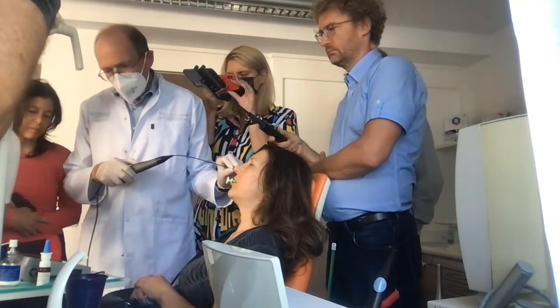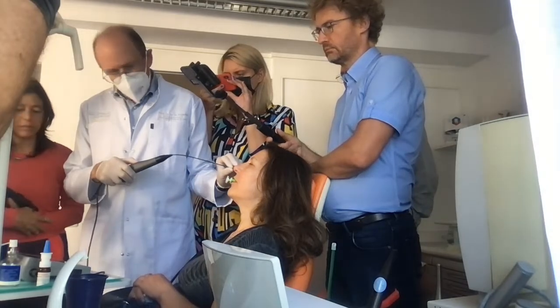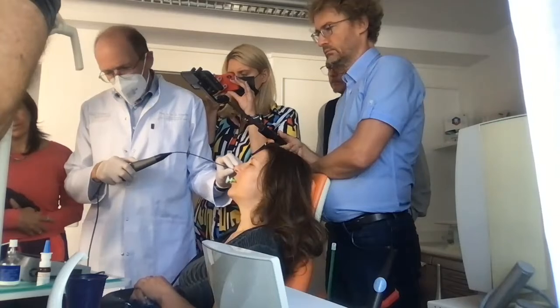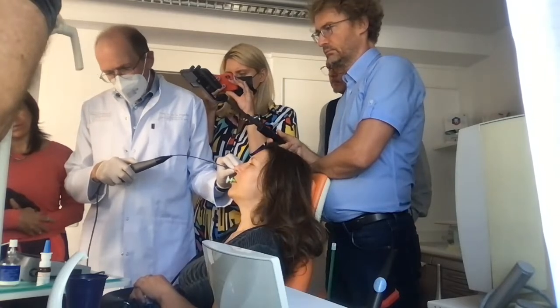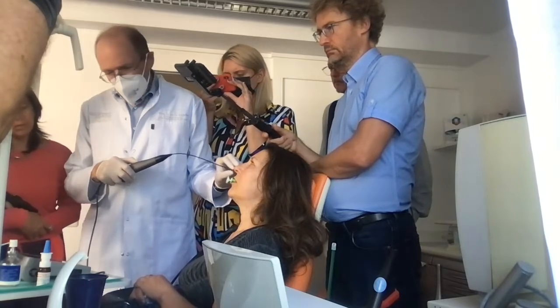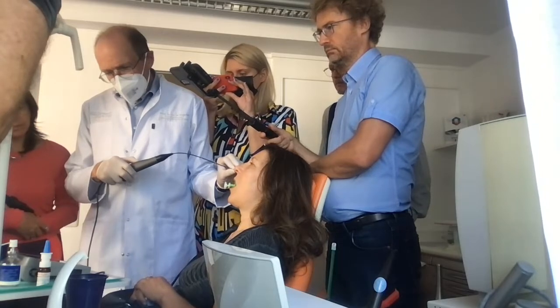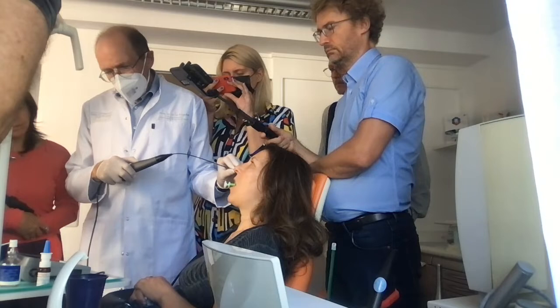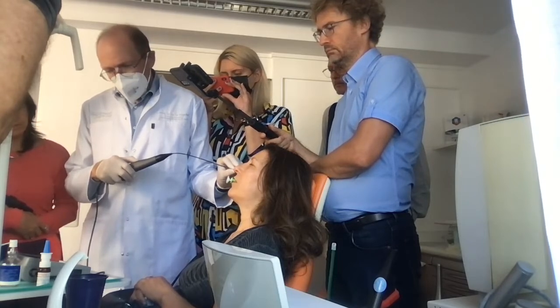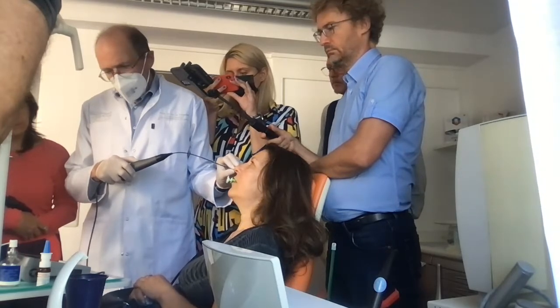Okay, please put negative pressure and breathe. And breathe. Nice, well working. So, more than the last one, almost. Or at least that. Breathe deeply. Okay, very good. And open your mouth. And please activate it. And breathe deeply. Activation.